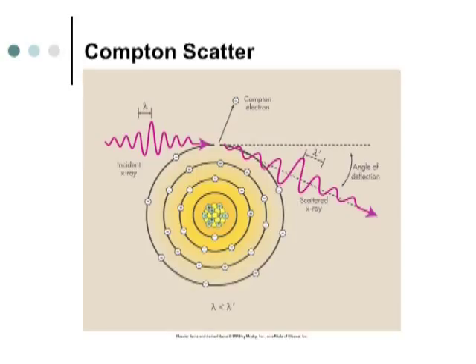This particular type of radiation, though, is harmful both to the patient and to you as an operator. And this is called Compton scattered radiation. This is the reason we wear lead aprons, because when the X-ray passes through the patient, if it hits one of the outer shell electrons, which are more loosely bound than the inner shell electrons, when it hits the electron, it will ionize the atom, meaning that it's going to knock this electron out of its orbit, but as it interacts with it, it will change direction. Okay? So if we're aiming the X-ray to the table to go through the patient, it hits something and now it bounces out of the patient in a different direction.